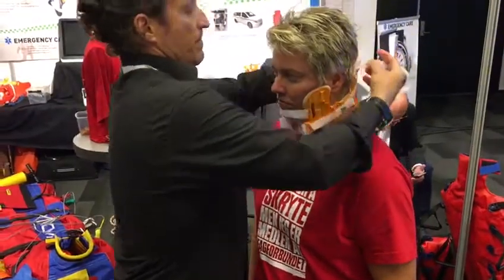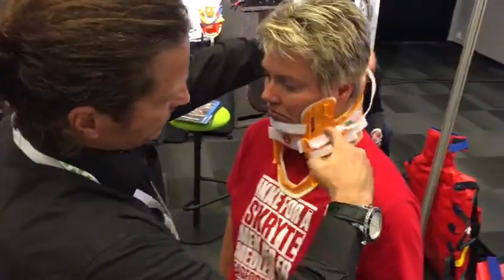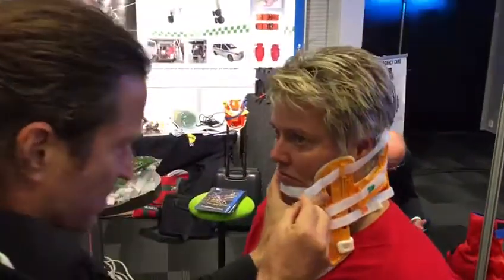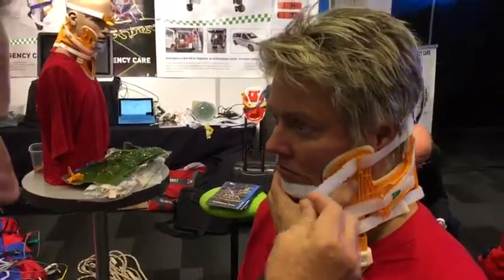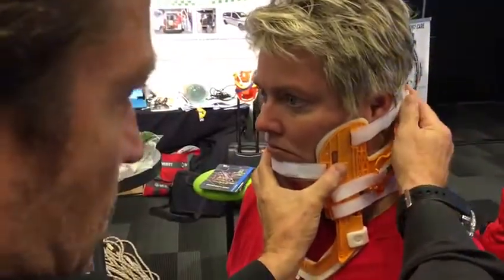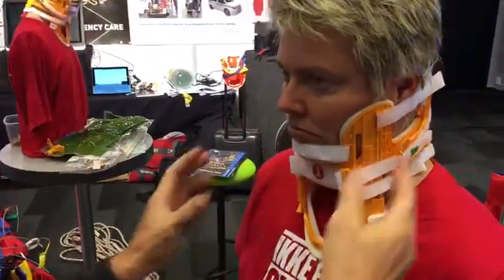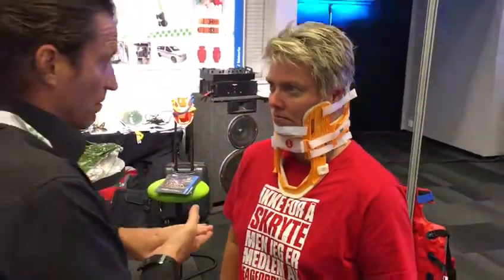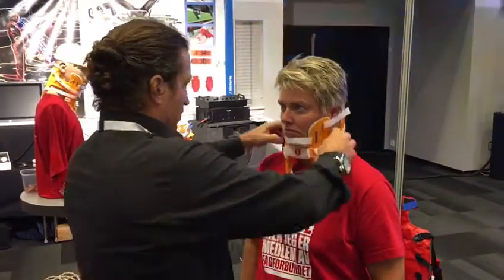We go around and take the slack of the strap. Feel the difference — it's even more secure. So if you have a patient with a neurological deficit or some type of paralysis, this is the best way to move them.